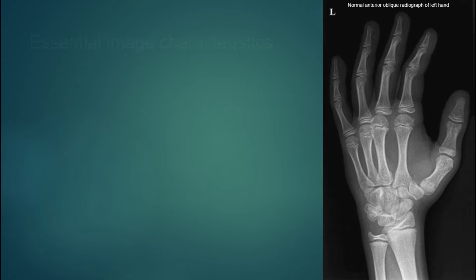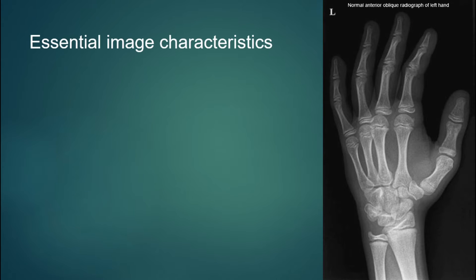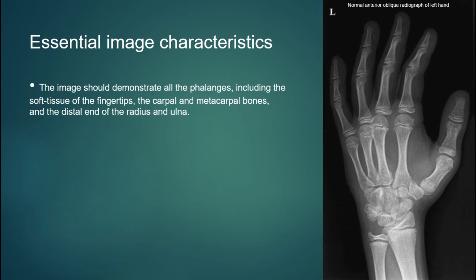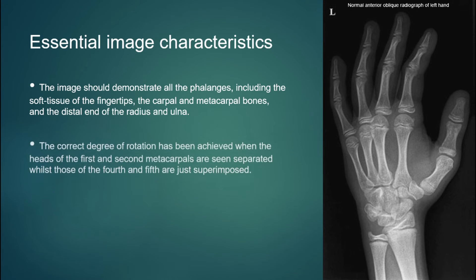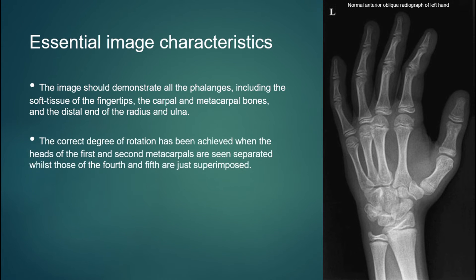Oblique view of hand x-ray. Essential image characteristics: the image should demonstrate all the phalanges, including the soft tissue of the fingertips, the carpal and metacarpal bones, and the distal end of the radius and ulna.